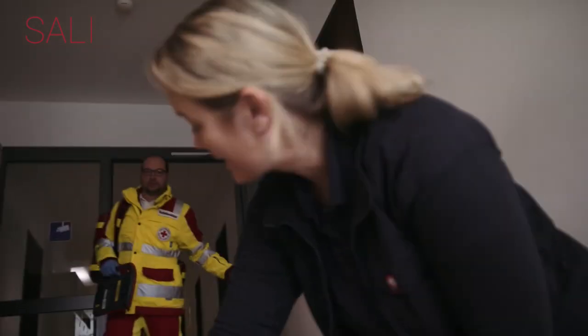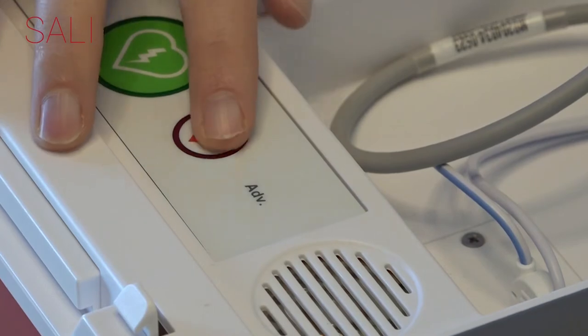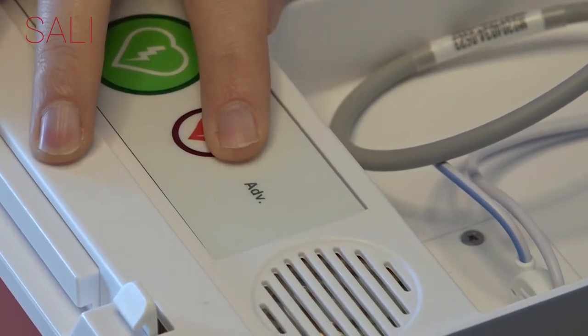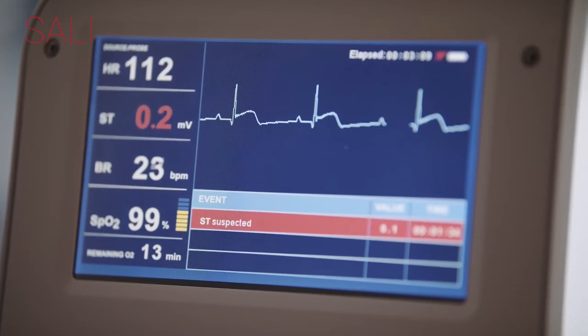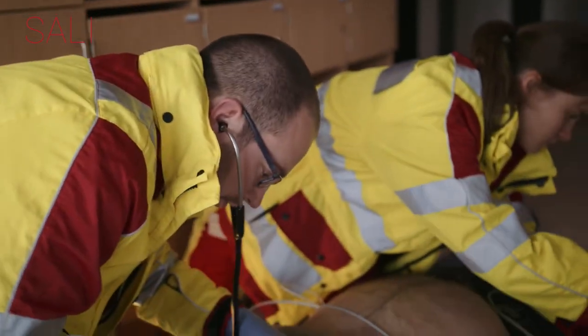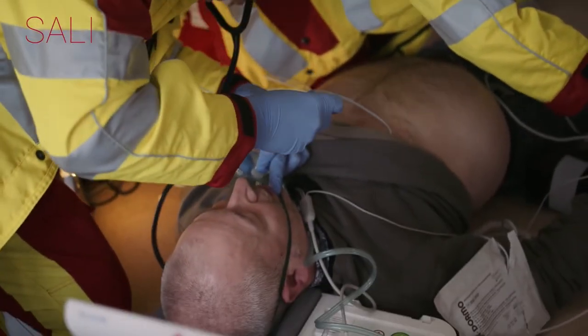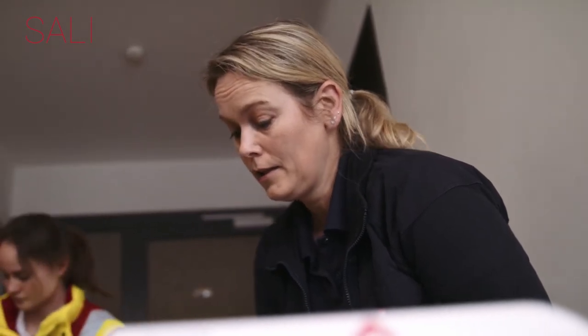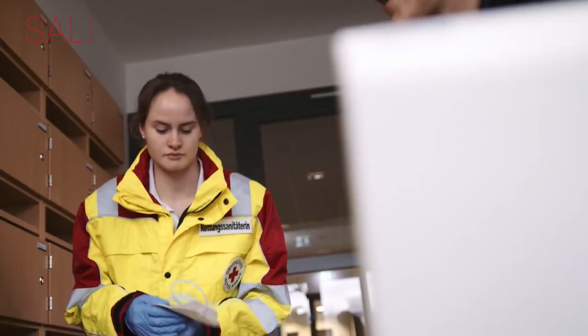A professional caregiver arrives. By simply pressing a button, SALI provides the caregiver with a professional monitoring display and a full record. The system allows any caregiver to save lives — not only in cases of sudden cardiac arrest, but in any out-of-hospital incident — enabling them to treat the patient regardless of his or her consciousness.